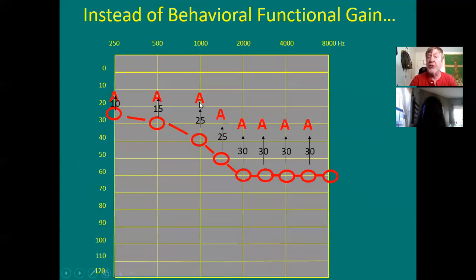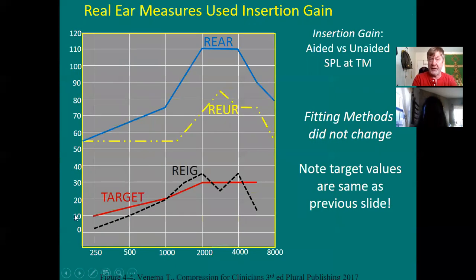Is the hearing aid doing what you want it to do? You see, the fitting methods predict. Now you want to verify. Verily, verily, I say unto thee, you want to prove, is the hearing aid hitting target? Is it doing what you want it to do? And here, is it doing what you want it to do? Oh, it's going a little under here, a little over here, a little under, a little over, you know.